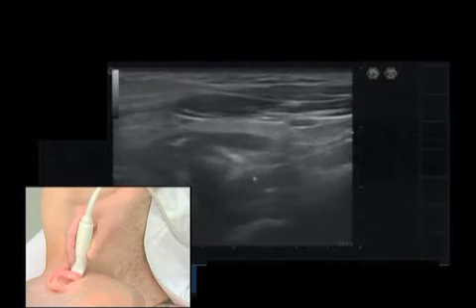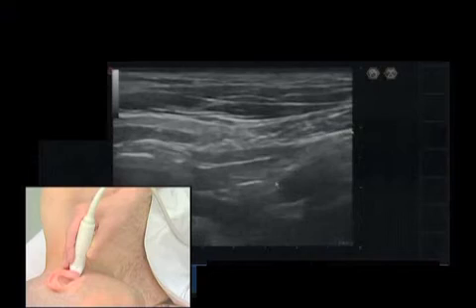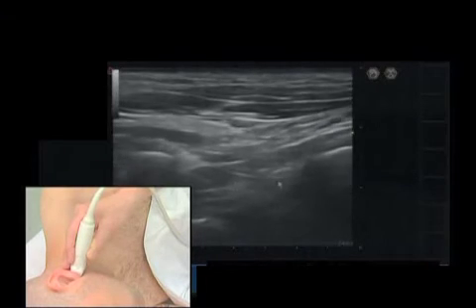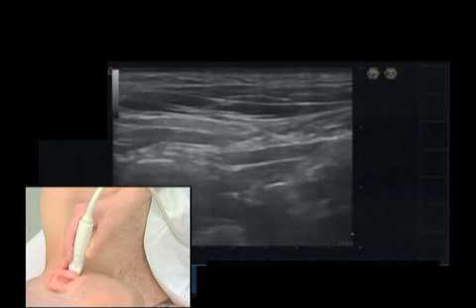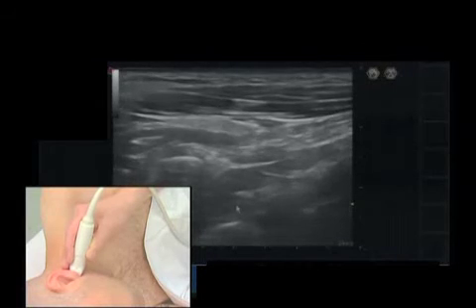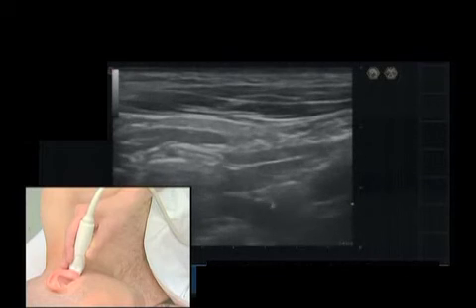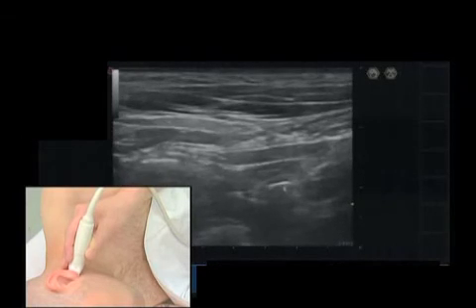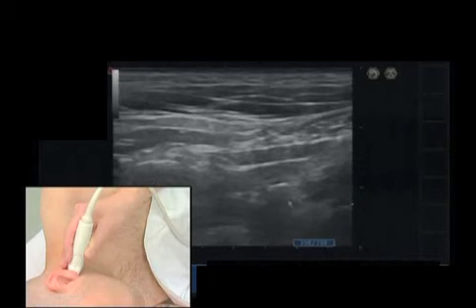The transverse process of axis is smaller than that of atlas. Another landmark important for us is the very deep area — the huge and thick pulsating vertebral artery. So we have the transverse process of atlas, the vertebral artery, and a very small bright reflex — I freeze the image — compared to the upper reflex and bone shadow, which is the transverse process of axis.